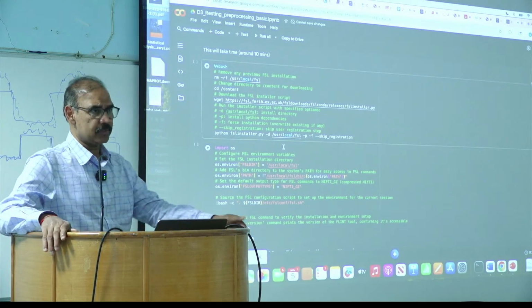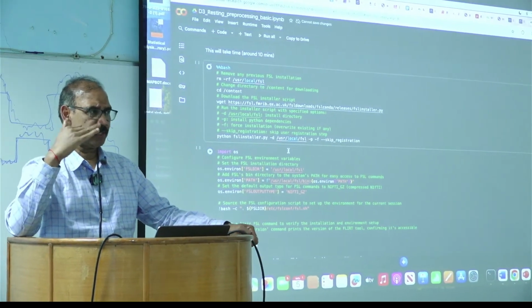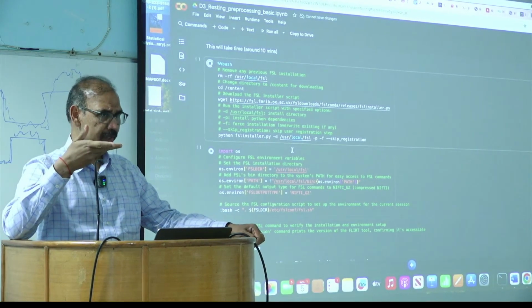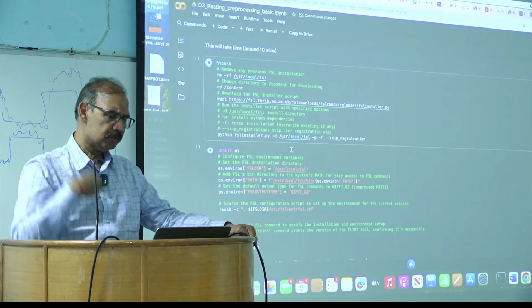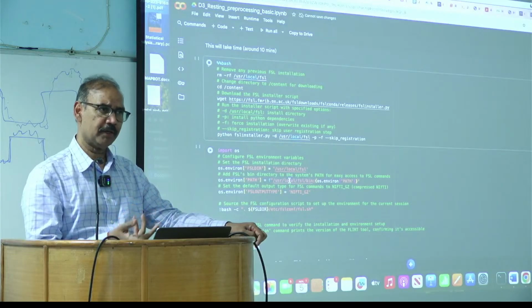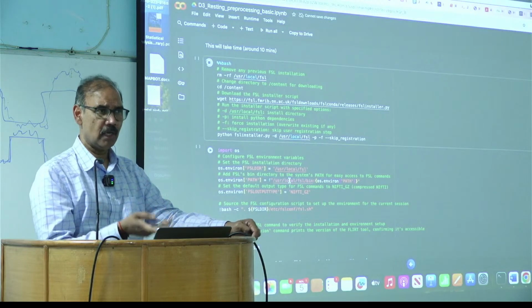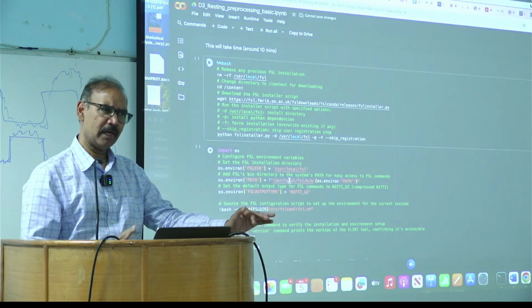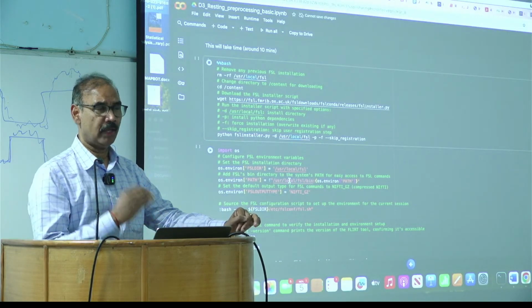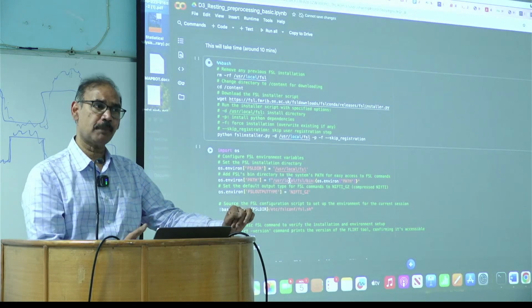That's a very good question. I think what he's asking is, does the step have to be sequential, and could we rearrange the order? Is that the question you have? Some of them you can rearrange the order, some of them you cannot, right? If you did spatial smoothing first and then did motion correction, it would be messy, right? Therefore perhaps you should first do the motion correction and then do spatial smoothing.